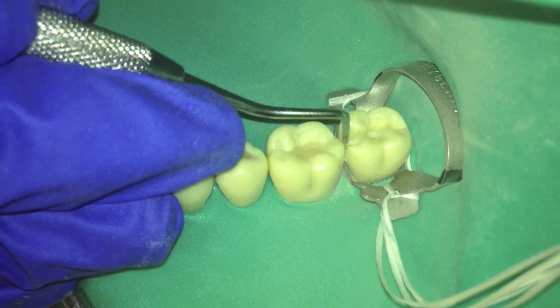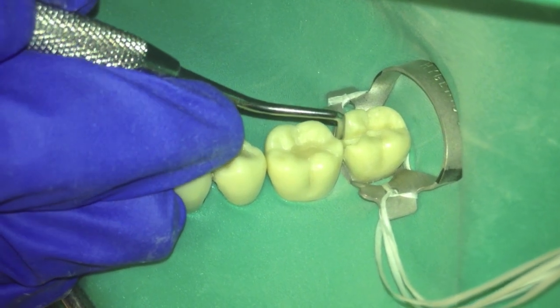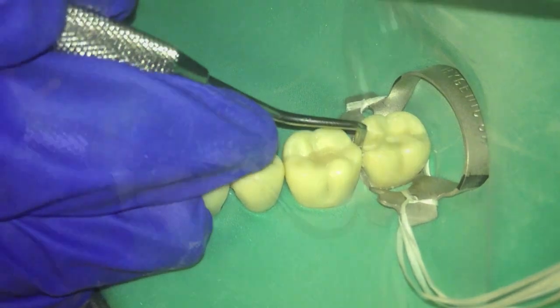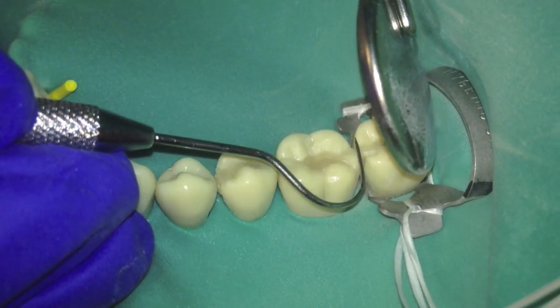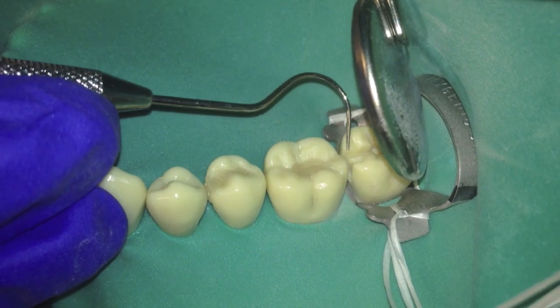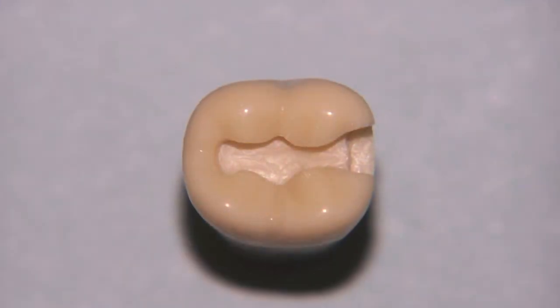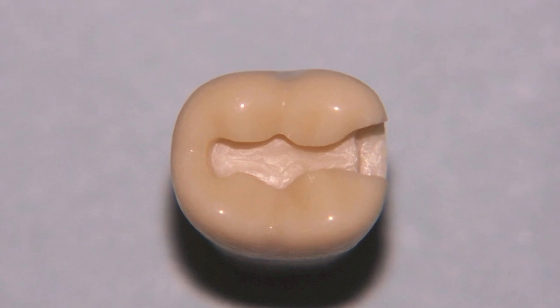The enamel hatchet is used in an apical direction to finish the enamel cavo surface margins of the box. The tine of the explorer should freely pass the proximal box cavo surface margins. The preparation is now ready for restoration.